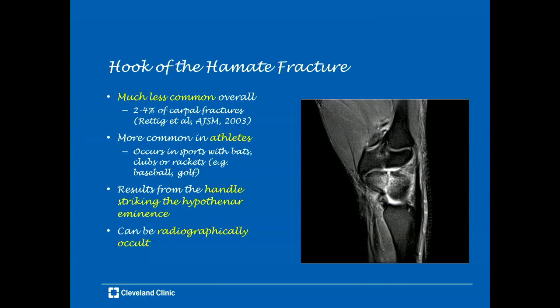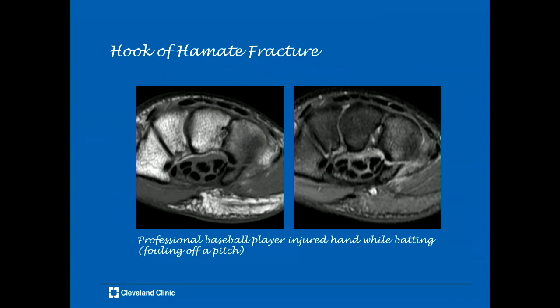A hook of the hamate fracture is another occult fracture where MRI can be particularly useful. It accounts for about 2–4% of all carpal fractures and is more common in athletes who play sports involving bats, clubs, or rackets, as it results from the handle striking the hypothenar eminence and fracturing the hook of the hamate. These can be radiographically occult. Here's a case in a professional baseball player who injured his hand while batting and fouling off a pitch. We can see a disruption of the hook of the hamate at its base on both the T1-weighted and T2-weighted images.